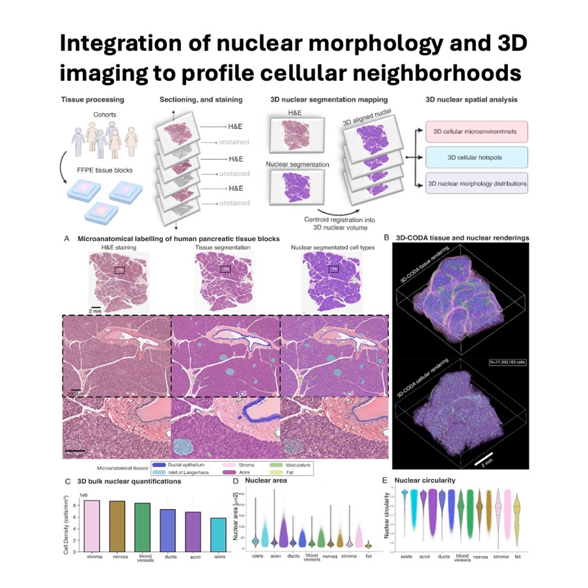Precisely. For decades, the standard approach in disease diagnosis has been looking at these thin 2D slices of tissue under a microscope. The H&E slides we often hear about. Exactly, the hematoxylin and eosin stain slides. And while they've been incredibly valuable for spotting disease markers, this method inherently loses crucial spatial information just by its nature. Right. So the research we're diving into today, this is work from Johns Hopkins and NPOD. It introduces a really novel approach.